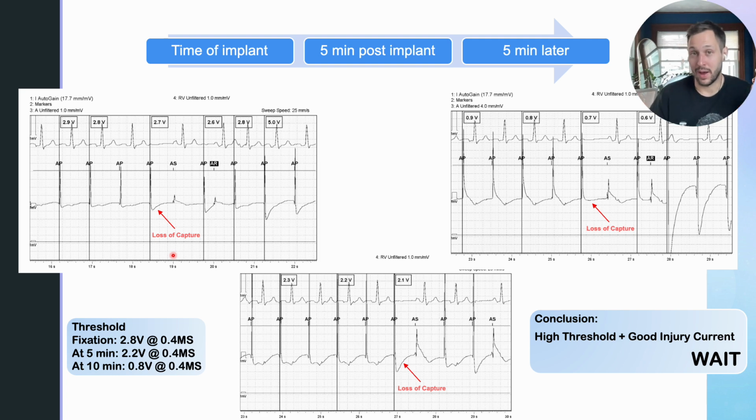The worst cases are when you have an atrium with no intrinsic conduction down to the ventricle and with no intrinsic sinus activity or backup. So you're kind of dealing with a dead atrium. It can be a little misleading. That's when your surface EKG is your friend. And that's why I always say, if you can hook a surface EKG up at implant, it will possibly save a life. So always have a surface, and then if you're testing outside with a device, always have a unipolar. But you don't have the unipolar option here. Have a surface. They're already in a setting, they're already sedated. Just put some patches on. It'll make life easier. All right, so we do our threshold test, 2.7 volts.